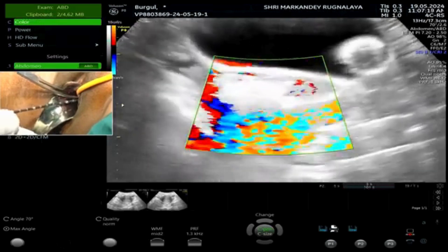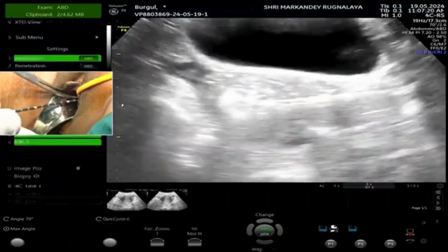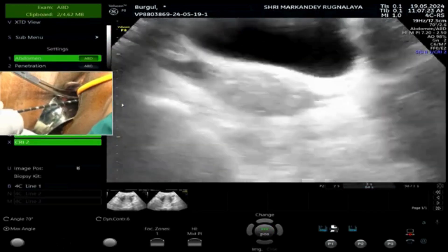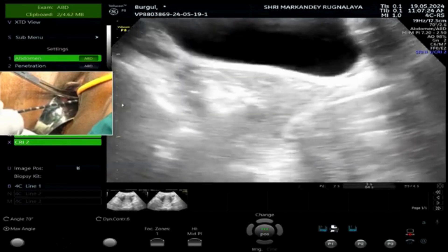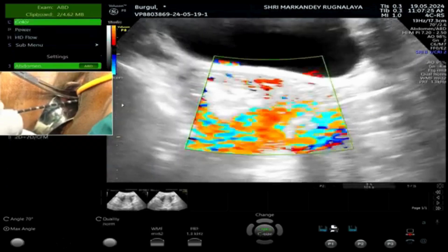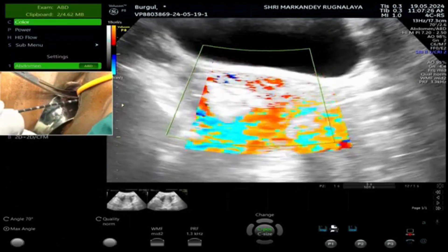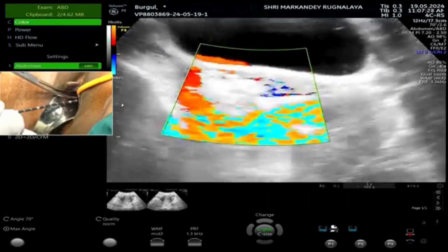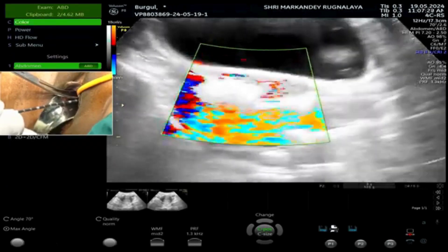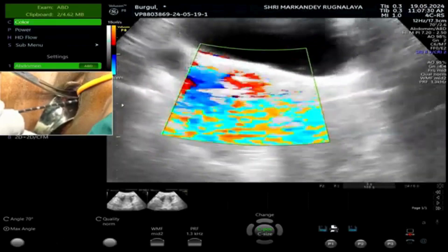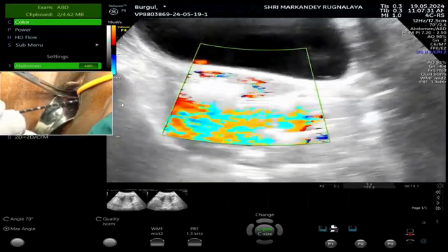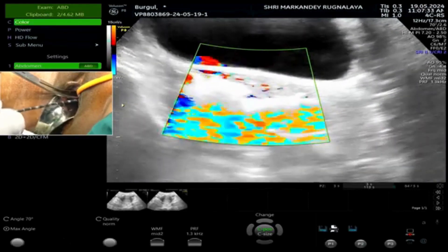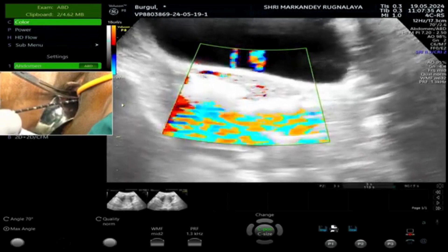I am going to check the endometrium with Doppler — any residual blood circulation or feeding vessels. Suppose a newcomer is doing this and accidentally perforates the fundus — what should we do?